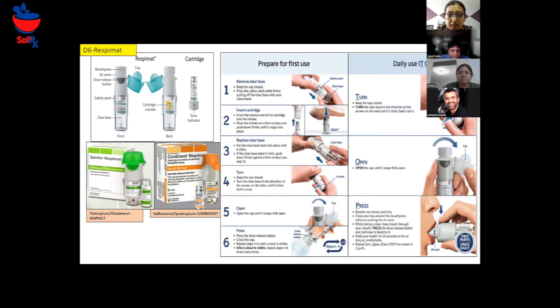If you don't hear the click sound, push down firmly again. Then hold the inhaler upright with the cap closed. Turn the clear base in the direction of the arrows — you'll see the arrows on the label — and turn it until you hear a click sound.